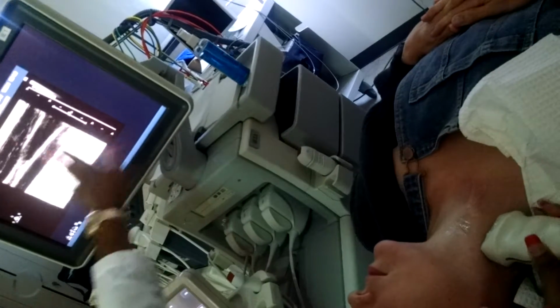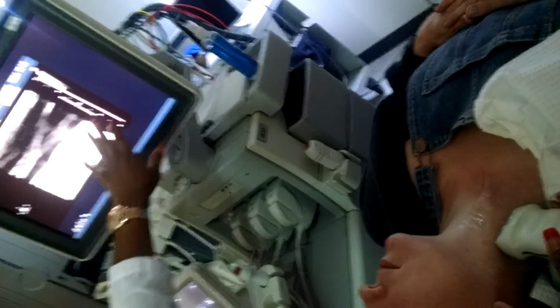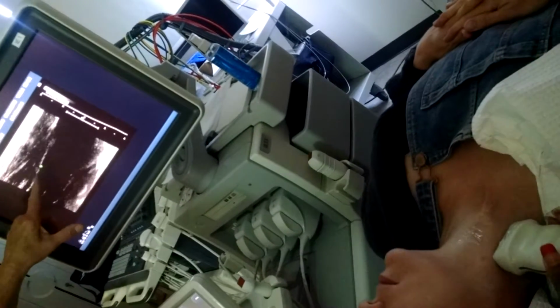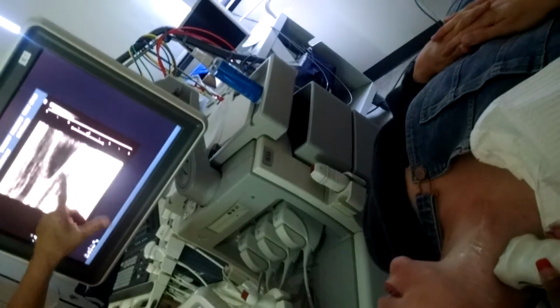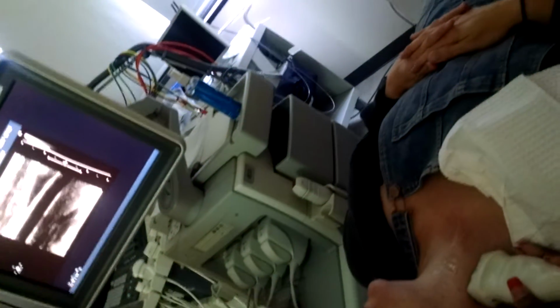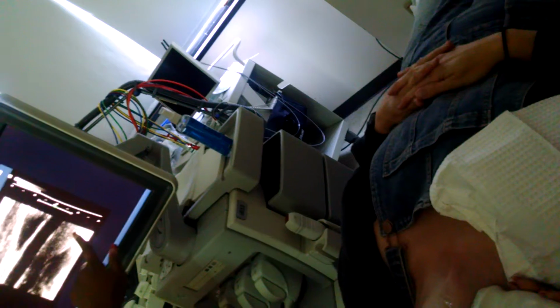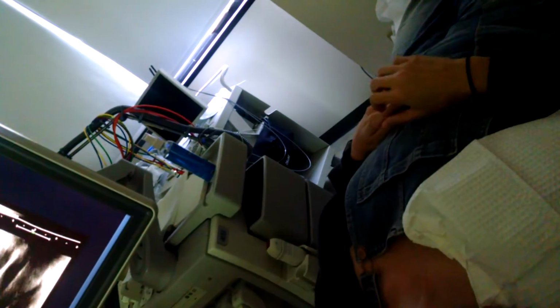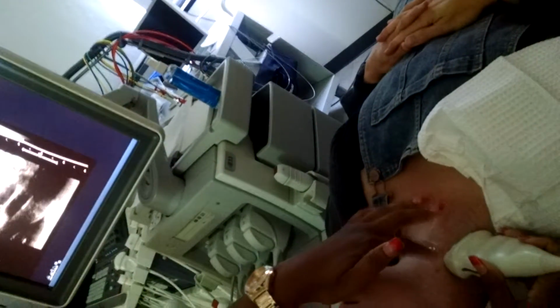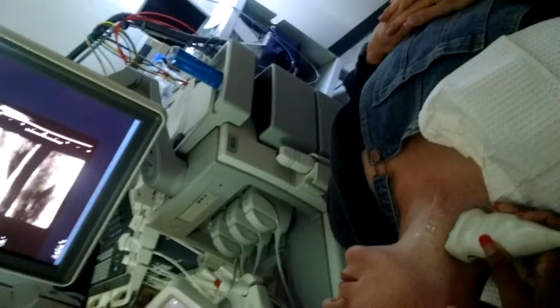And make sure you try to open up your vessel end to end so you're not what we call obliquing it, cutting it off. How do you not do that? You've got to twist and turn your probe. This is towards the feet, so not like rocking, but moving it like this. If I do this, I'm obliquing it. This is towards the head, so I'm going to bring this out to open that up.